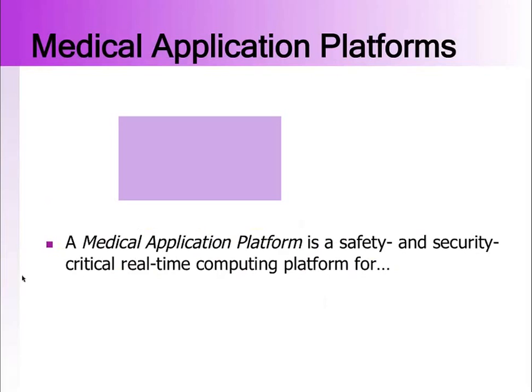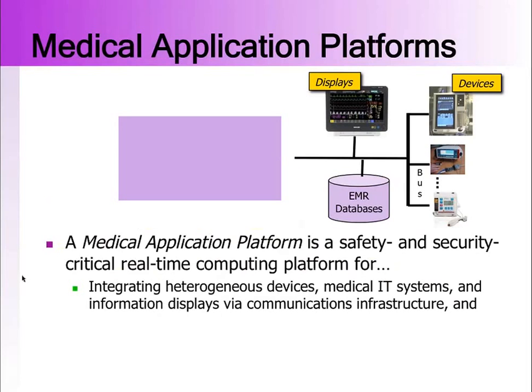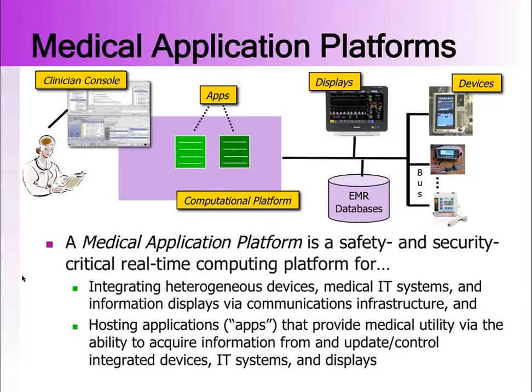So a medical application platform is a safety and security critical real-time platform for integrating heterogeneous devices, meaning devices that may come from different manufacturers, medical information systems, as well as information displays and communications infrastructure. And it's not only networking, it's hosting of applications that provide medical utility via the ability to acquire information and update and control integrated devices, IT systems and displays. It also provides a rich graphical interface windowing system that the clinician can use to interact with the system and the apps that are running on the system.